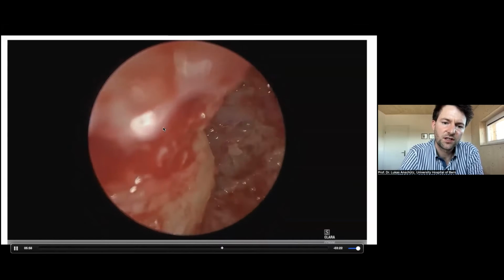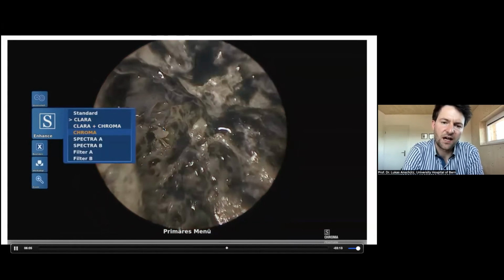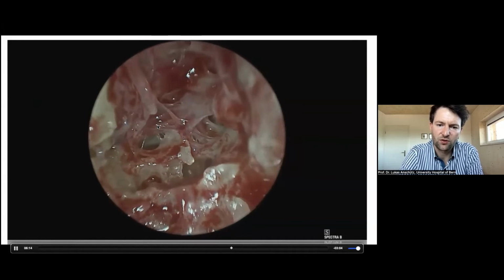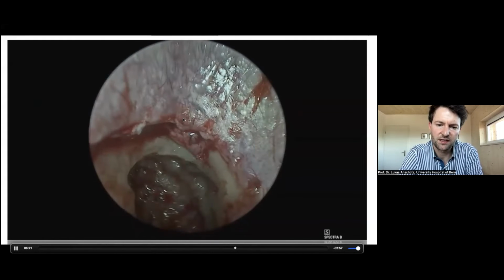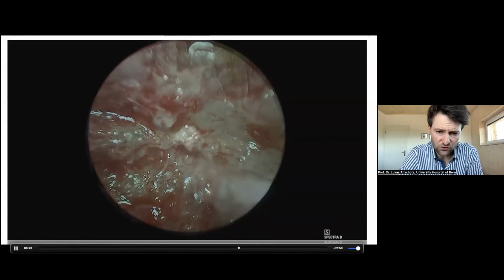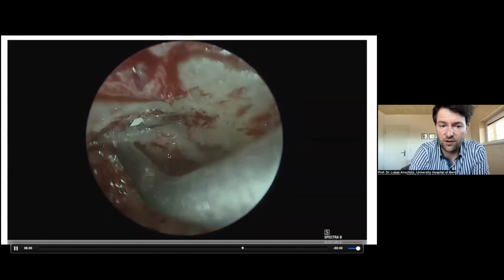You can see this is scar tissue on the cochleariform septum. And again, I use some digital image enhancement to check if I have some cholesteatoma rest. And you can see here, this is really just the granulation tissue. In this video, I show you this is the canal skin. Skin is very bright in this technique, and so I can decide a little bit easier if I still have skin or not. This might be skin, so I'm going to remove it, because in this kind of approach, if you start to remove all the granulation tissue, your surgery will take forever.